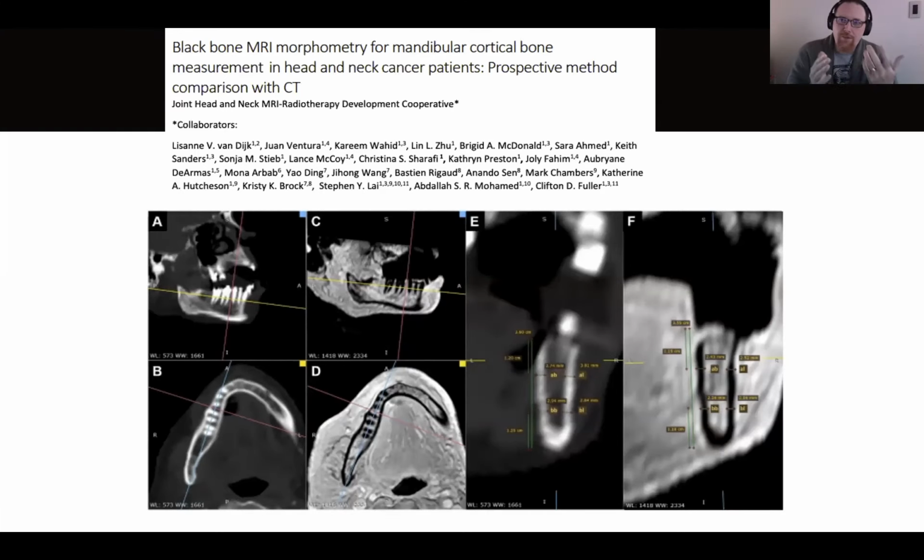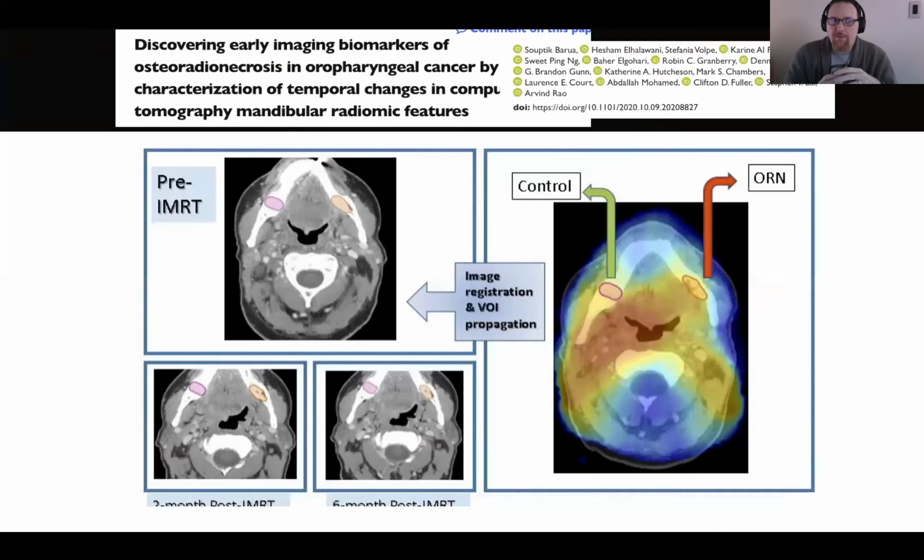So very shortly, we're going to be moving over. Instead of getting a CT and an MRI in every patient, now they can save a step. Now, this doesn't mean that the CT is worthless. Some other work within our group has been looking at what if we could use radiomics to detect these vascular changes potentially within the CT scans rather than having to get this complicated MRI.